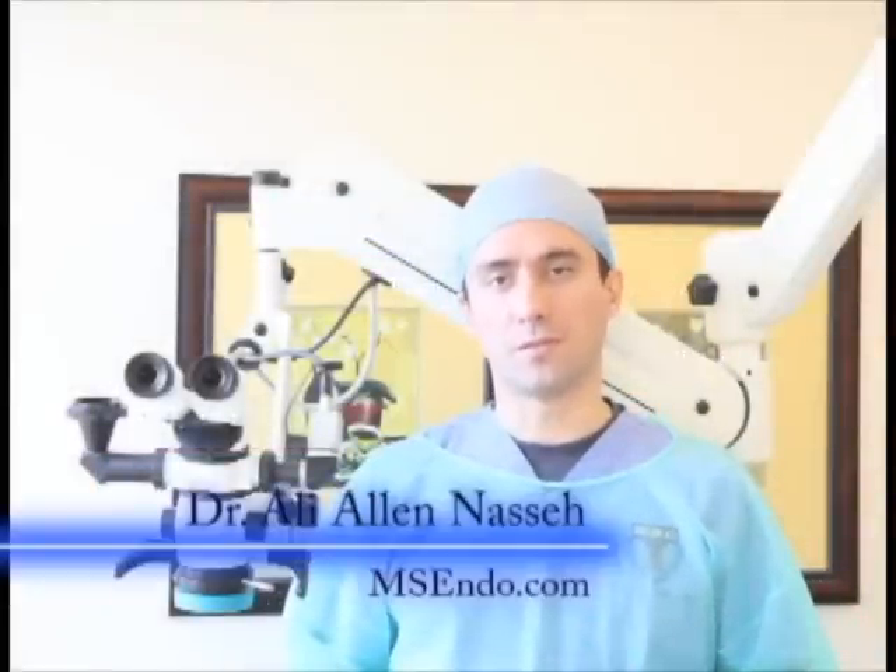Hello, and welcome to Microsurgical Endo Educational Institute. My name is Dr. Allen Nasseh, and today I'd like to share with you a simple and efficient method I have developed for post preparation using the EndoSequence instrumentation and obturation system. This is a very simple technique that also allows cementation of the post immediately after the root canal.